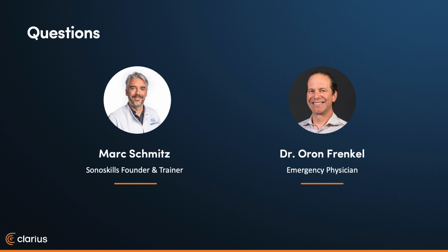Sometimes not so easy to see is a chronic bursitis. In chronic bursitis, you don't see any anechoic effusion, but the bursal blades, the peribursal fat tissue itself, the white lines, which are the boundaries of the bursa, they are thickened due to chronic friction of the bursa. So not so much effusion, but more thickening of the hyperechoic bursal tissue. So those are maybe a few points which may help you in clinical practice to start scanning those bursas. But there's much more to tell about it because it's a big topic.